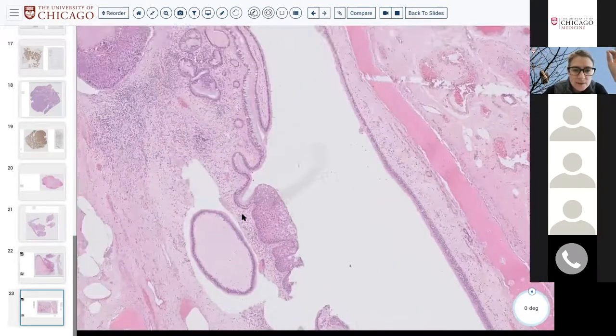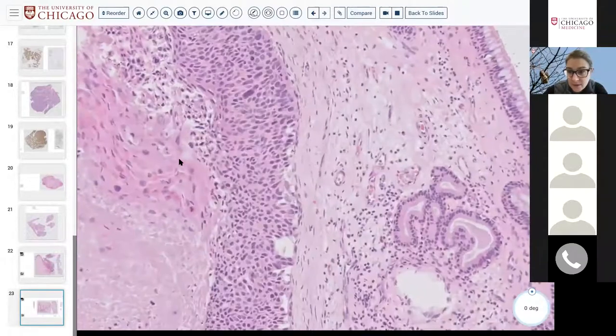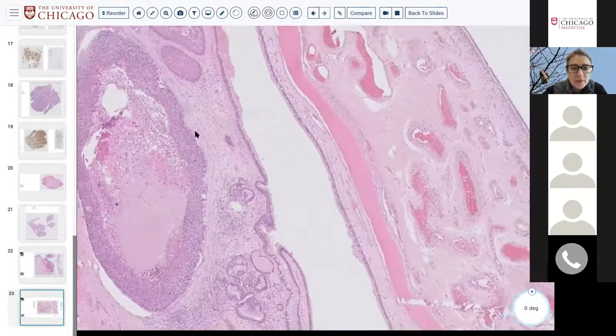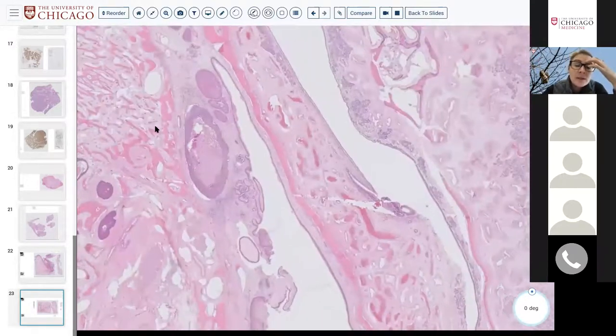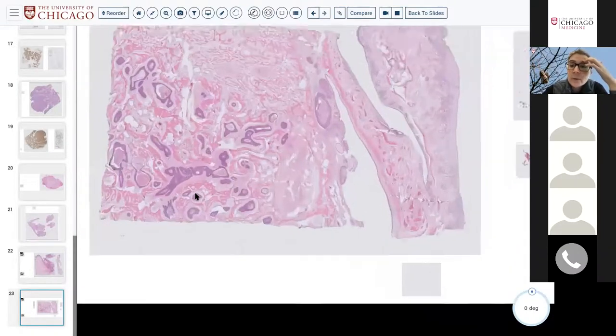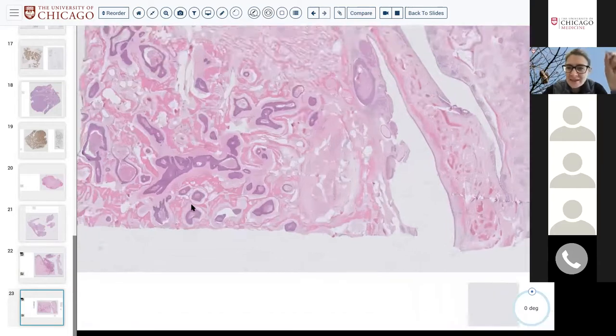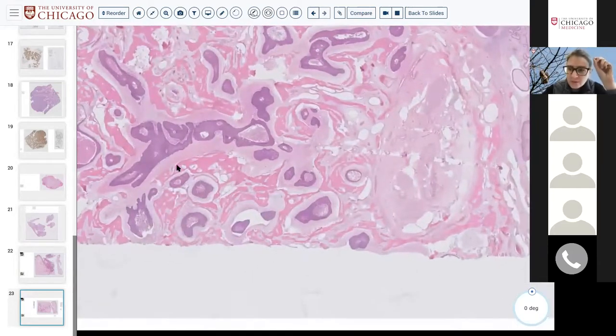And you also see it transform, right, to this malignant thing with keratinization, with atypia, carcinoma ex inverted papilloma. Yeah, so this is a rare example, but a very, very florid example of the kind of things you're looking for when you see sinonasal papillomas.